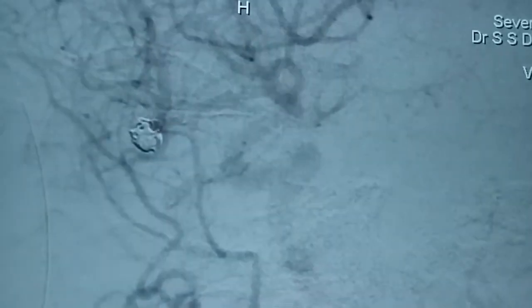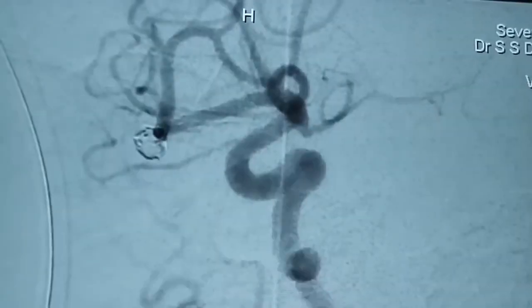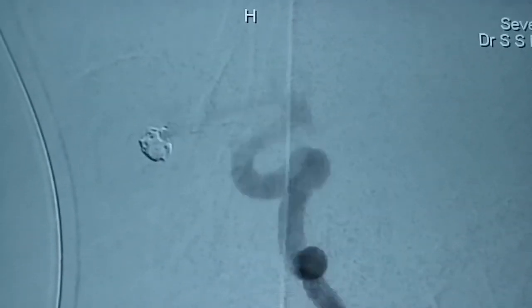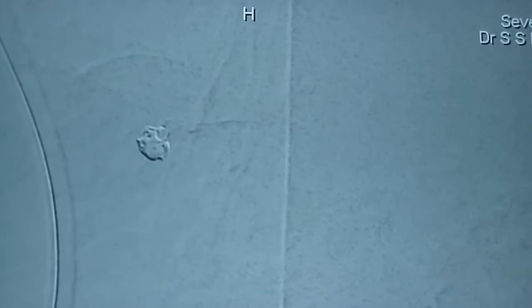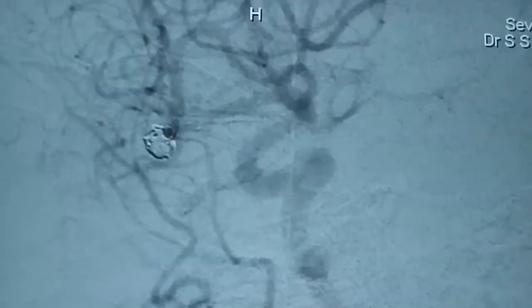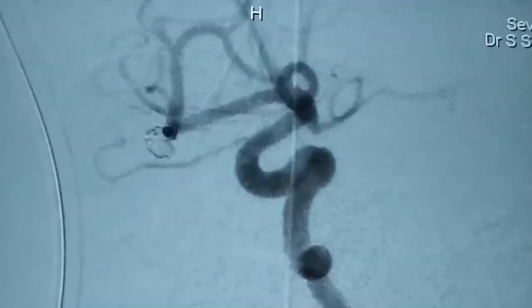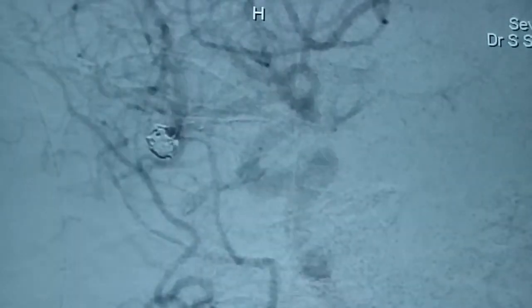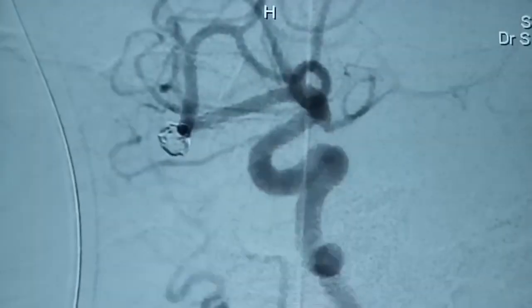This is the final angiogram demonstrating complete exclusion of the aneurysm from the circulation, with both M2 branches being patent. This shows a successful coiling of this wide neck right MCA bifurcation aneurysm, which was acutely ruptured. We had to put a stent because we didn't have any other good option, and we got a fantastic result in the end.